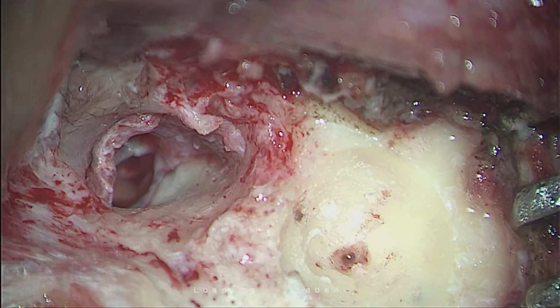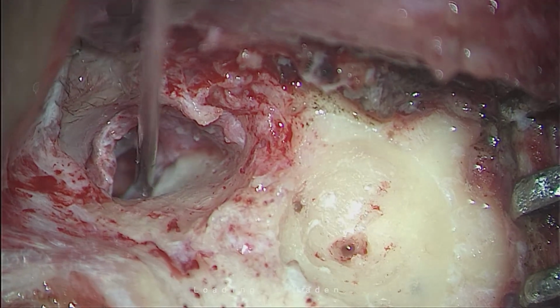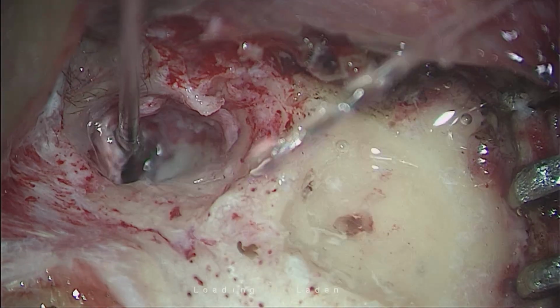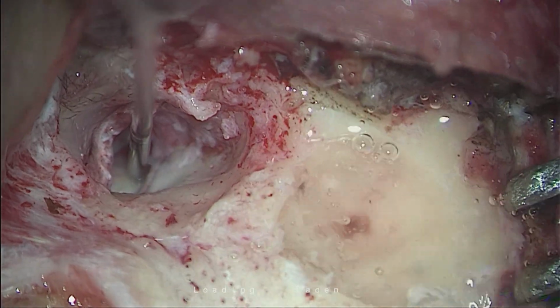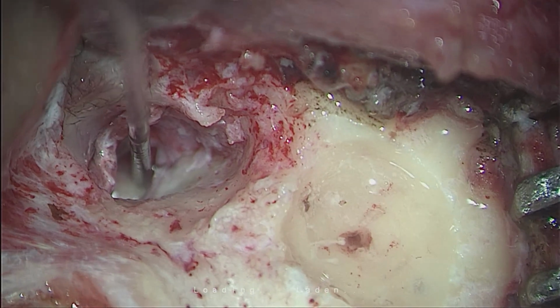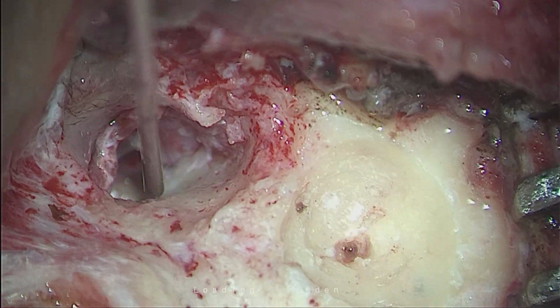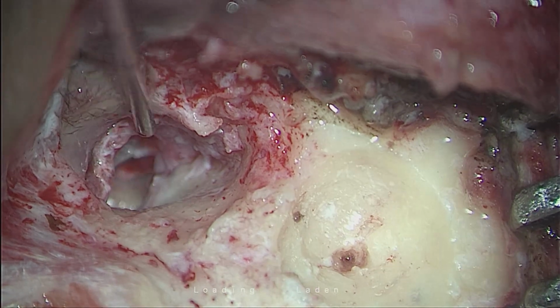mastoidectomy. So this is a test, mind it. There should be no confusion. I am not recommending cortical mastoidectomy or anything for every case. This is my direct confirmation, on the table confirmation of patency of the mastoid air cells down the Eustachian tube.